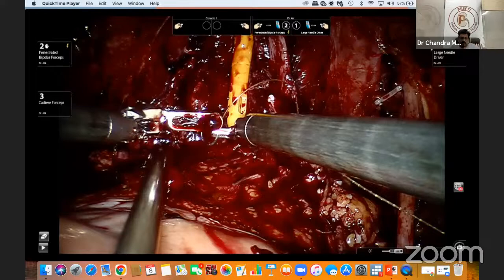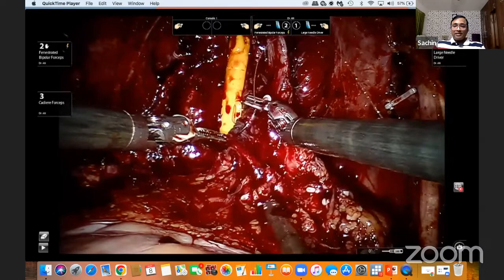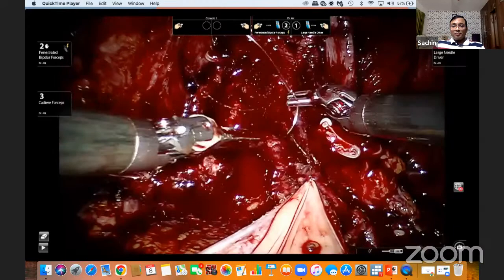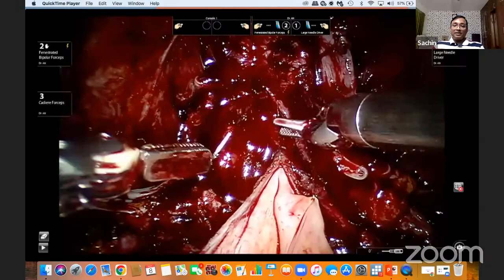So this is a new bladder. The first step in the new bladder is taking this so-called Rocco stitch. What I take is the Denonvilliers fascia, the cut edge of peritoneum, which helps, and the rhabdosphincter muscle below the urethra. It not only gives hemostasis, it pulls the urethra inside the abdomen, and also gives stability for the bladder plate.